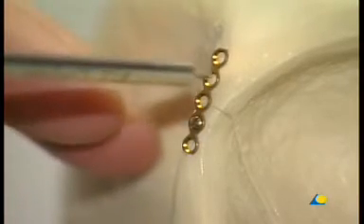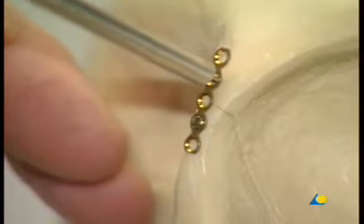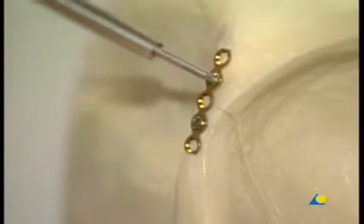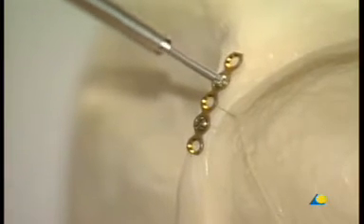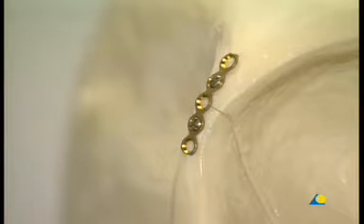Another 6 mm long 1.3 mm screw is inserted. These 2 screws provide some stability and allow the zygomatic arch and orbital aperture to be reduced. The 2 additional screws are placed on either side of the plate after the other fractures have been fixed. The hole over the fracture line is not used.